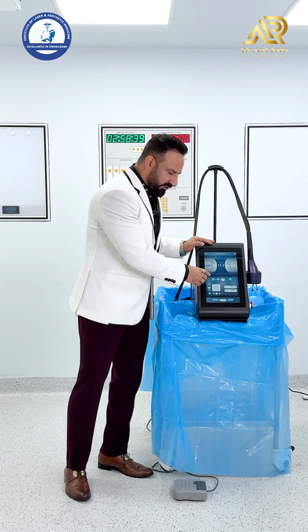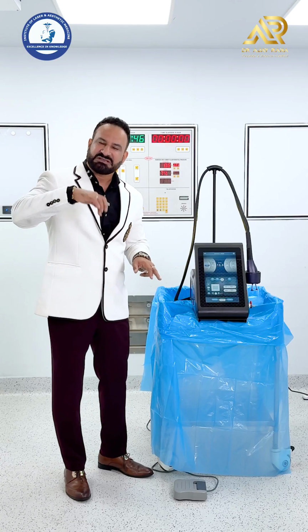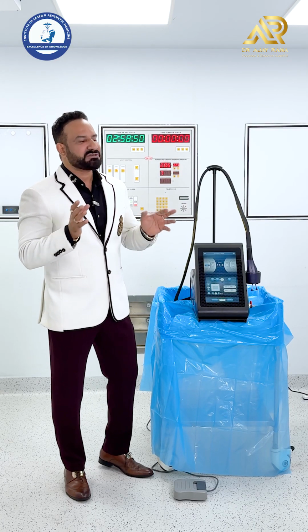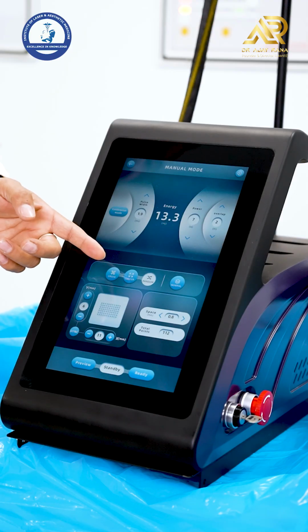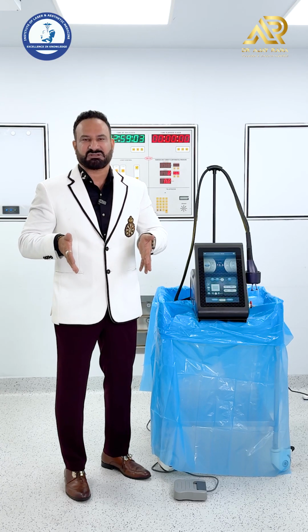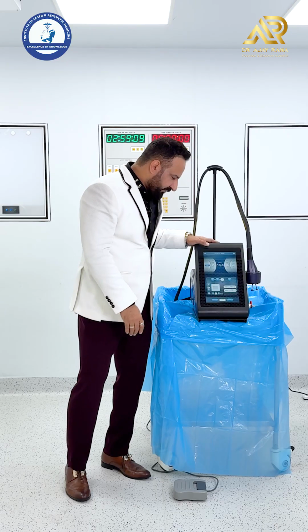Alright, then there are different options in terms of how you fire. You fire in a random manner. When you select random, the fires will come in a random manner, and the advantage is the patient will not feel the pain or the heat at one particular point. The other option is center, so the beams come from the center and march outwards, and the third one is orderly, in which it is marching forward, and so on.